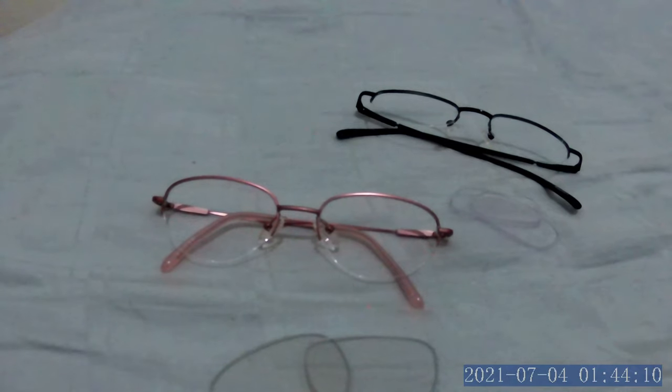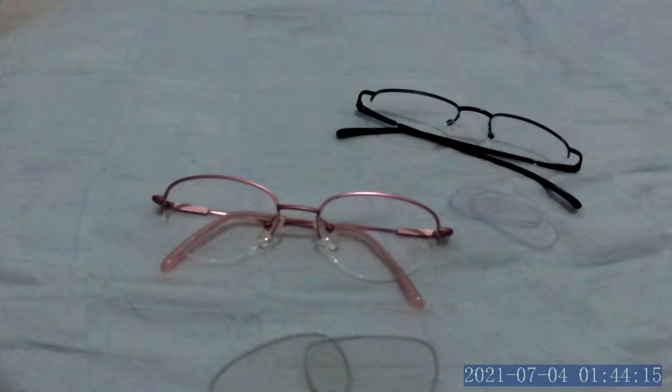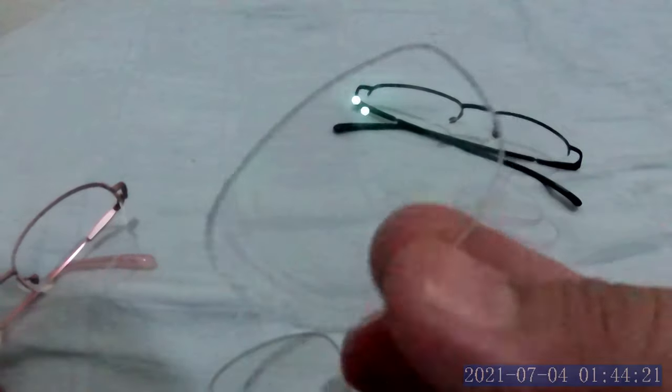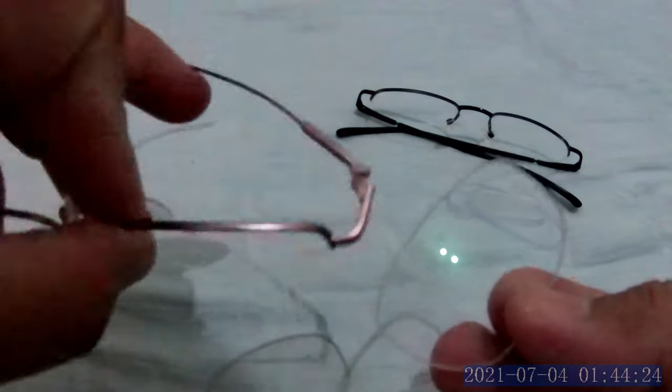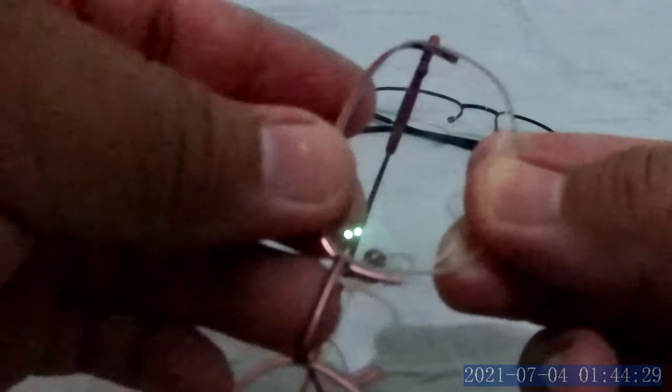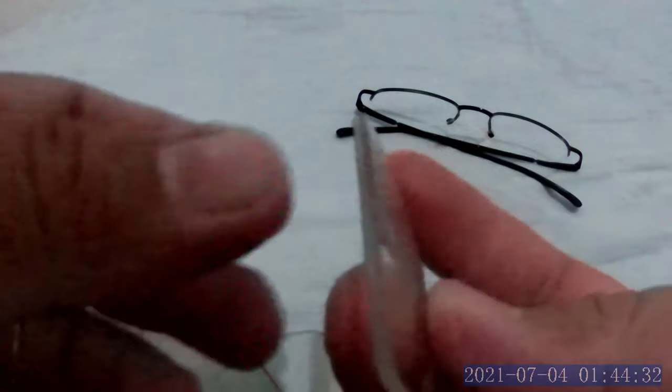Now we'll insert the lens. For example, this is the new frame and you have your old lenses that you want to reuse. All you need to do is find the groove on the frame. Insert the lens on the nasal part first, then the arm or temple part. You can see the string — that's what holds the lens in place.